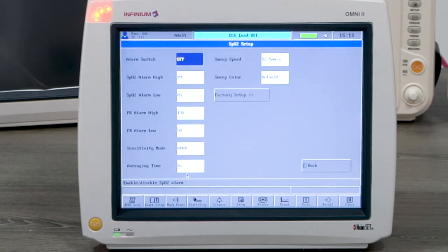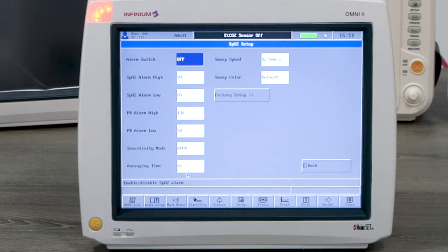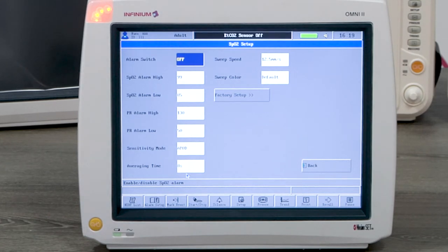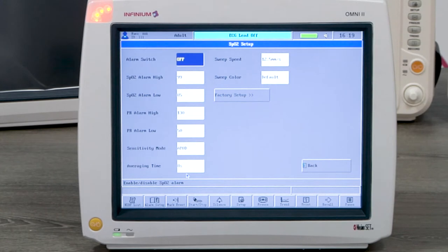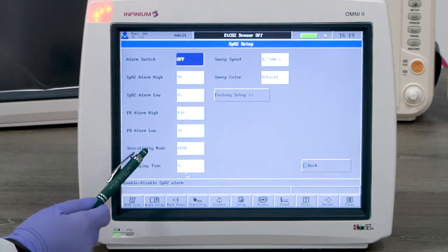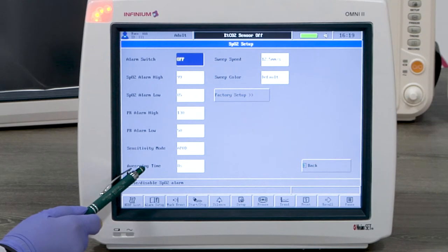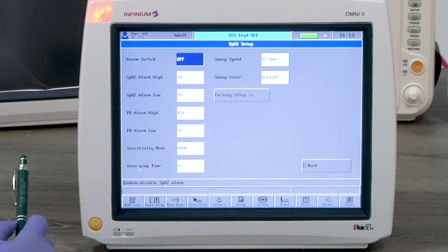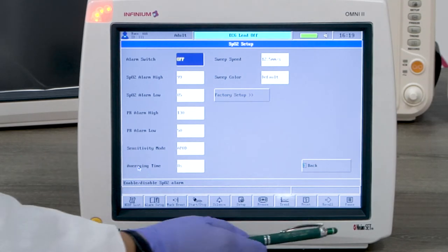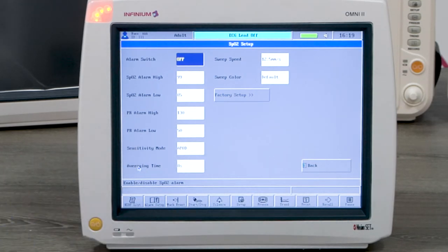Now let's look at SpO2 monitoring. Tapping on SpO2 reading or PLETH waveform window will enter the SpO2 setup menu. The setting can be changed according to the user's preference. Sensitivity mode and averaging time are only available if Massimo SpO2 is installed.